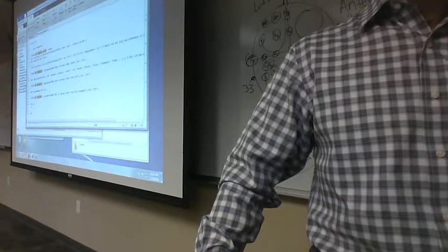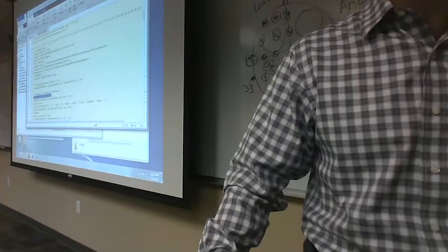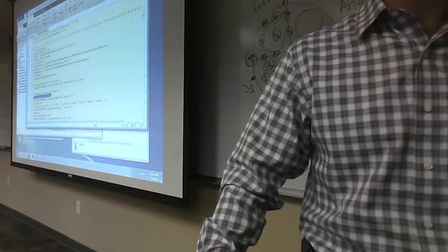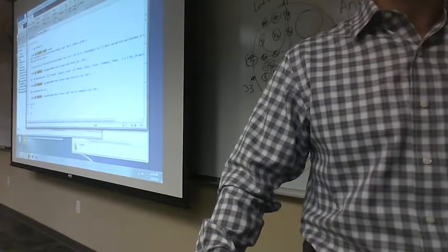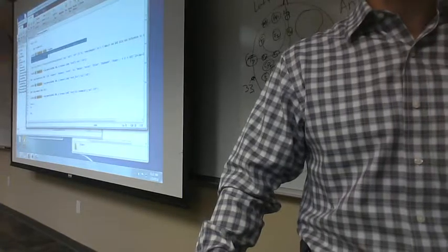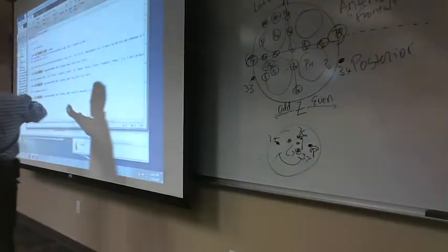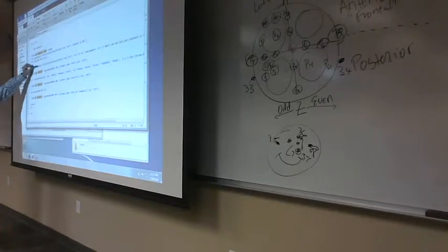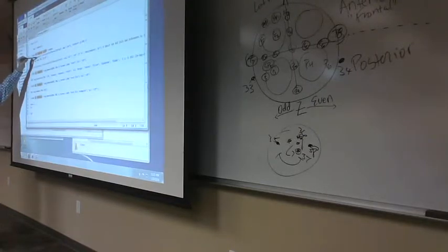All right. So what I did was we switched a couple things around here, and here's what we'll look at. When we add these commands, we switched it around just a little bit. So we used to have this command. Now notice I use this comment sign to basically clear it out so the computer won't run this. So I grabbed another command which is roughly the same thing, pop biosig.